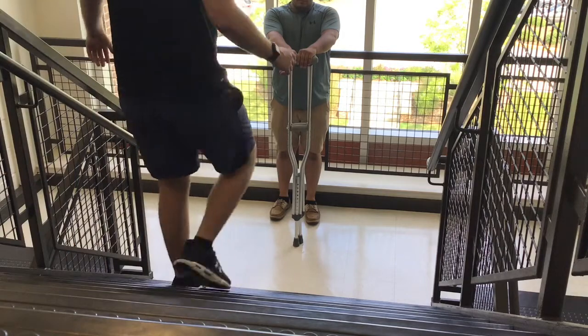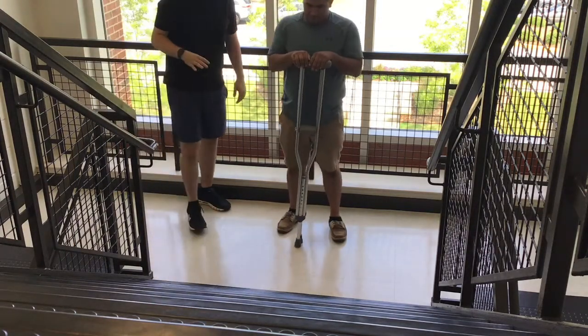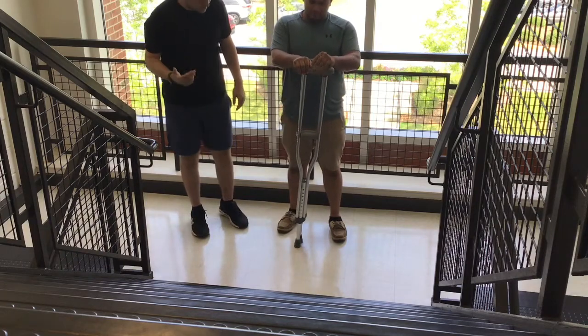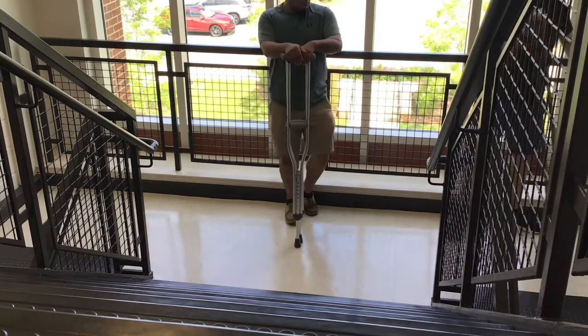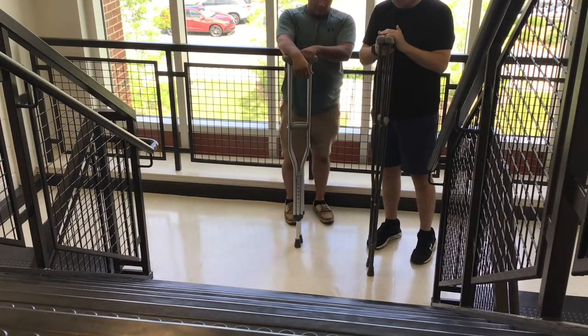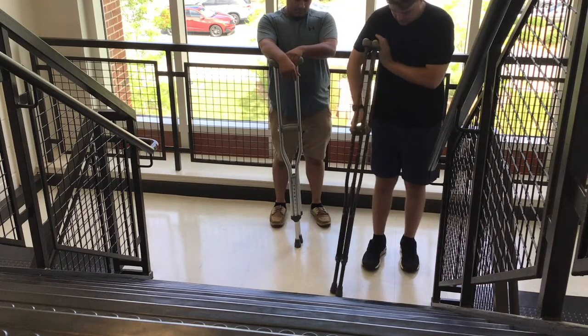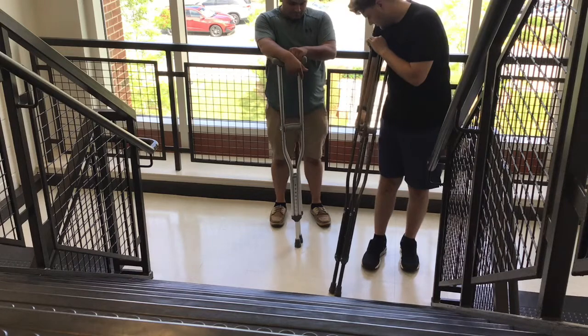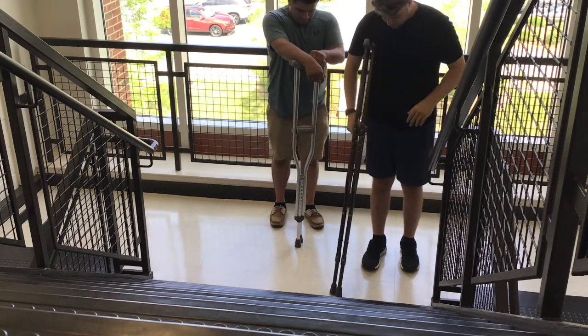Alright, so Marcus is still with us, he's still on his crutches, so we've got to teach him how to walk up and down the stairs. So, Marcus, what you're gonna do is when you get up to a staircase like this, you're going up the stairs, you're gonna take both crutches and put them on the side that is not injured. So in this case, since your right leg is injured, it's gonna be on your left side.